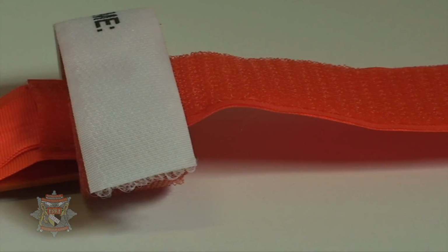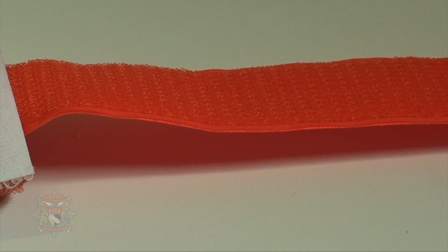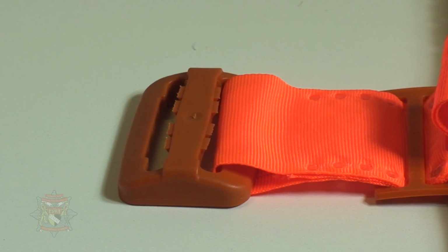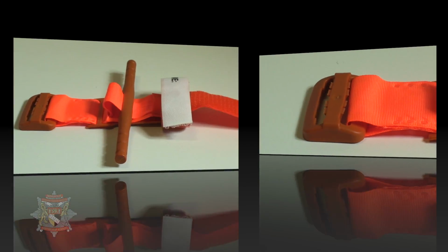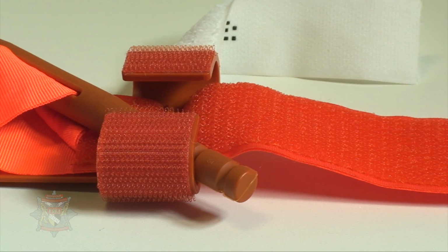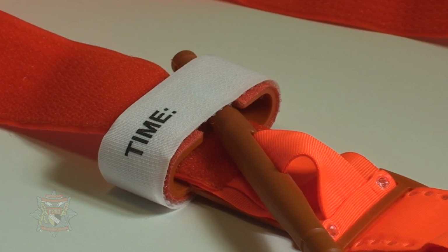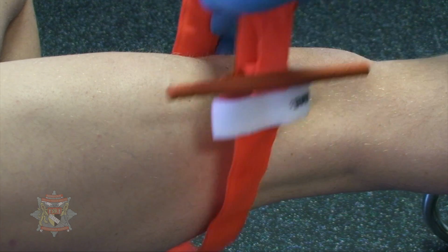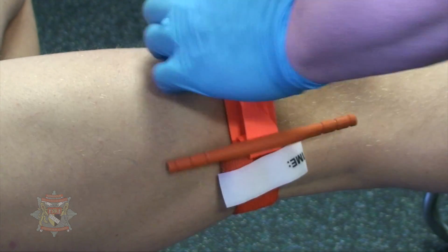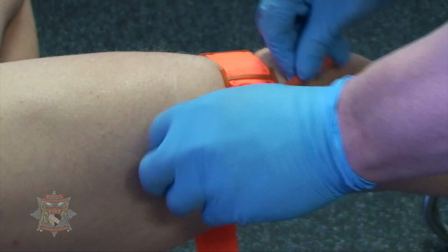The device consists of a self-adhering polyester strap, friction buckle, windlass rod, locking clip, and a securing tab with a facility to record the time of application. Whilst it is preferable to place the tourniquet directly onto the skin of the patient, it will still be effective over layers of clothing if access to the skin is not feasible.